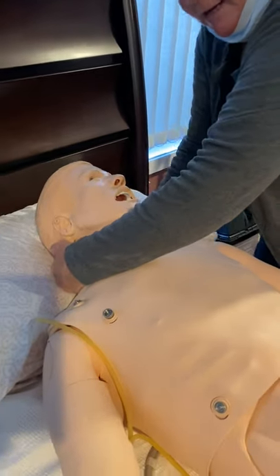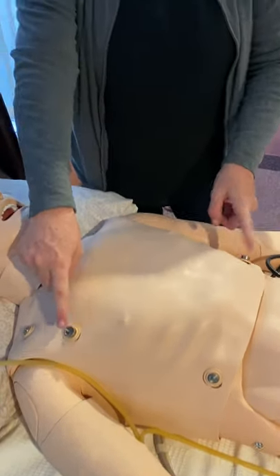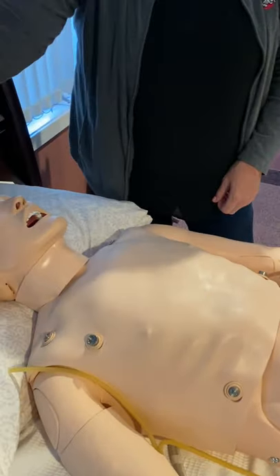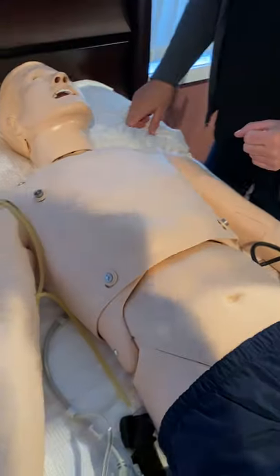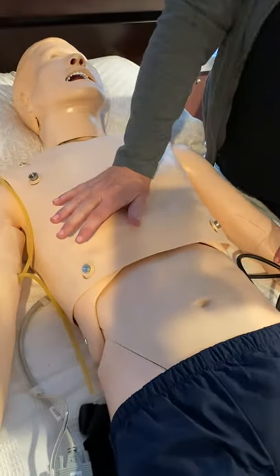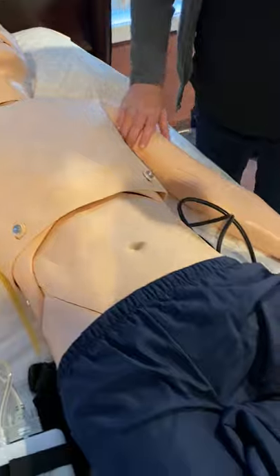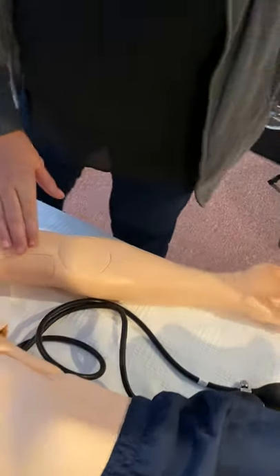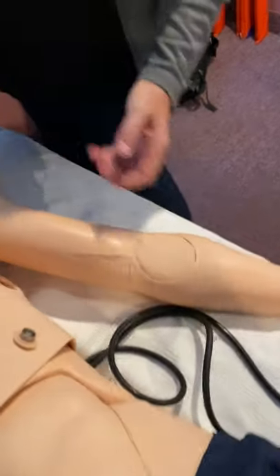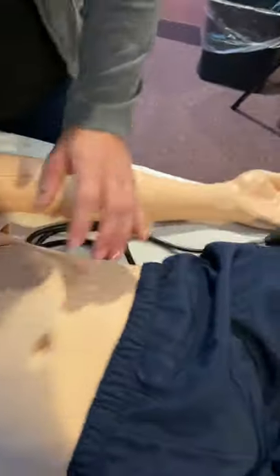He can be defibrillated, paced, and cardioverted. These are his two defibrillation sites where the defib cables snap in and connect right into your physio, so you can get all of that output from his cardiac rhythms through these connections as well as through his ECG connections. Here's where all his sounds are — you can do CPR on him. He's got heart and lung sounds, all anterior. He also has bowel sounds. This arm is for brachioradial pulses and blood pressures. He also has a site here for a chest tube.